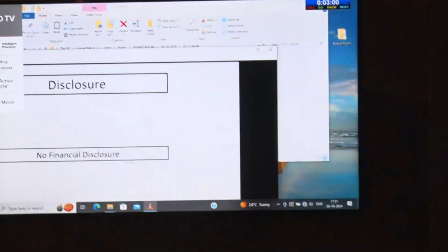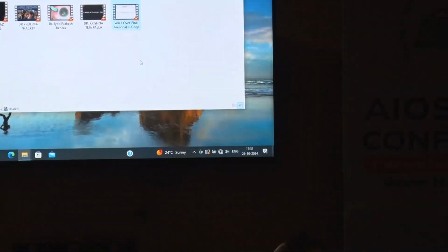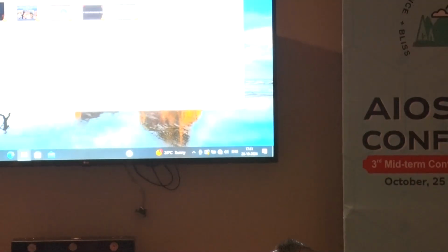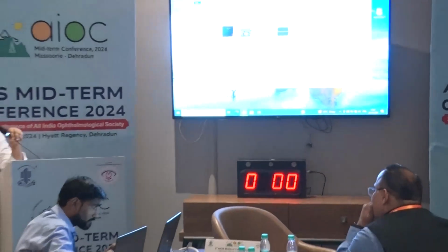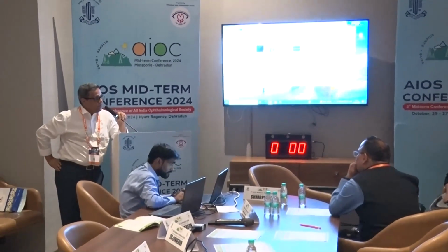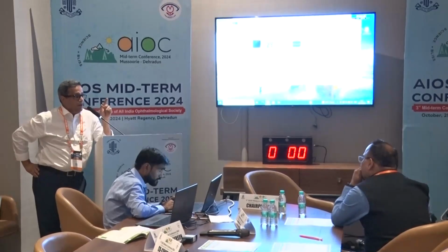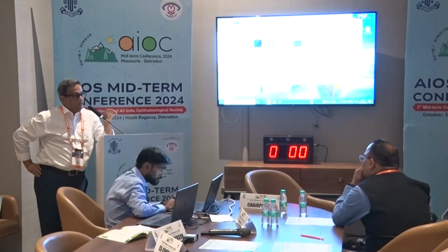Can this technique be applied in PPC cataract? Yes, I have done those. But what you see is most of the PPC cataracts are subcapsular. They are not polar. In polar cataracts also, because you are keeping the IOP at a very low level, I am not doing a hydrodissection in those cases. But yes, I have done a couple of cases.